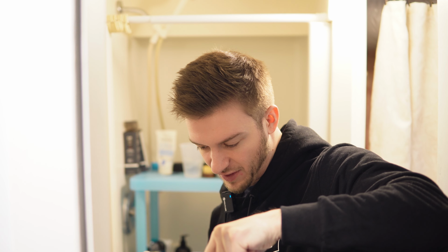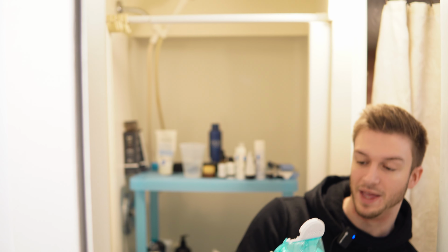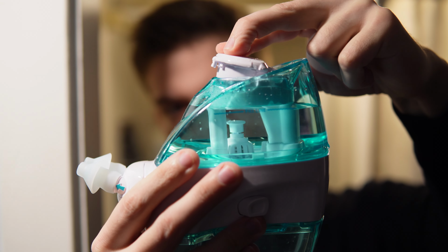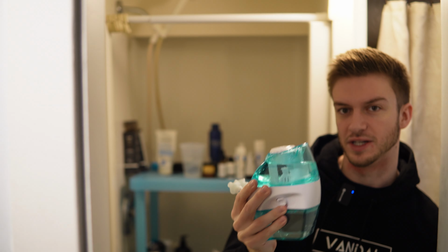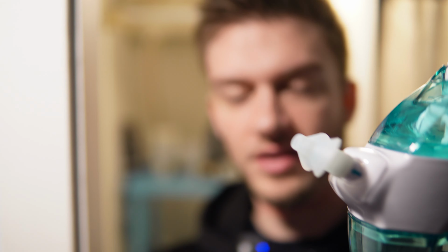There's a fill line that we have to fill it up to. So you're going to see the fill line there. Once it's been filled up, then we can pop in the pod. It'll come with pods, and there is a way to reuse these, and I'll be making a video in the future on how to do that, but it's simply pop it in there. The top's going to shoot it down into it. As you can see, now there's the saline in the water. That's exactly what we want. I like to give it a little bit of a shake too, just to make sure that it's fully mixed in there. And then next, there's these lines here.